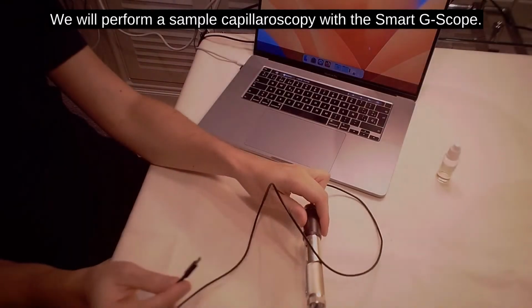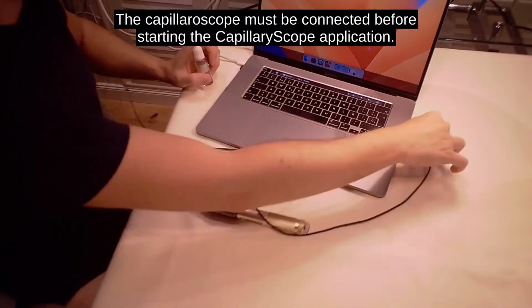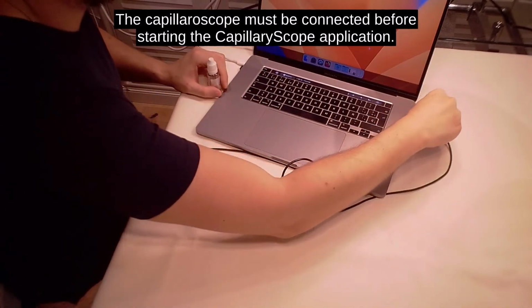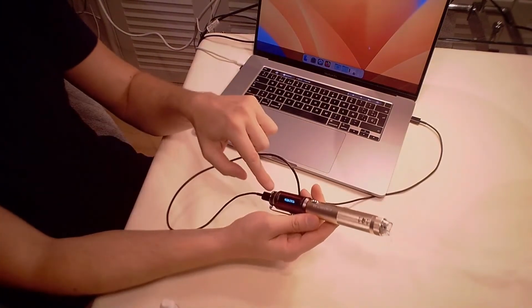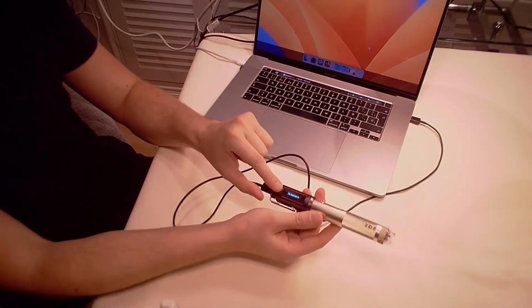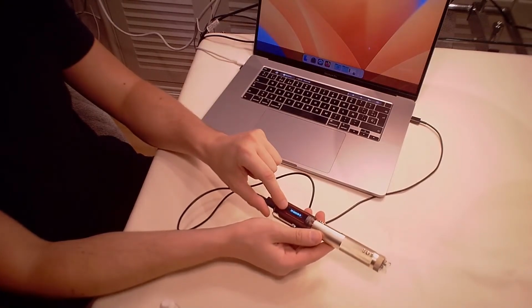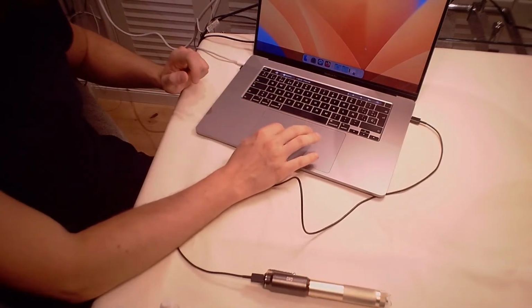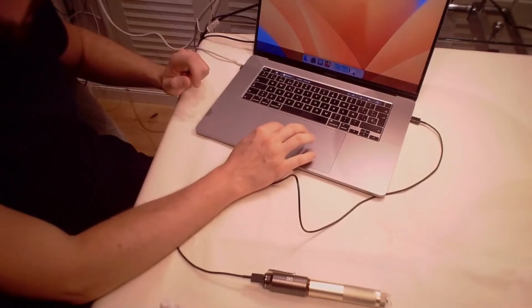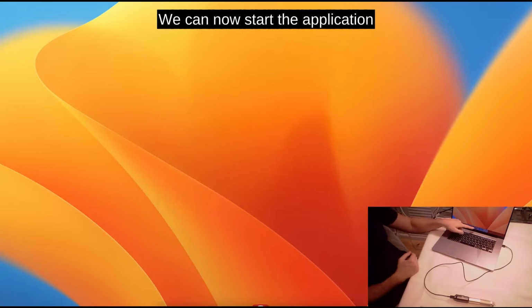This is how we are going to do a capillaroscopy. An important detail, although very easy, is that the first thing we have to do when we want to use the Capillary app is to connect the video capillaroscope before starting the application, so it can be correctly recognized. In this example, we are using the G-scope, and we see that the light turns on when we connect the system, and the software automatically recognizes the capillaroscope.